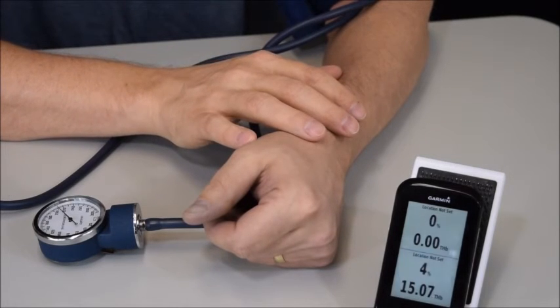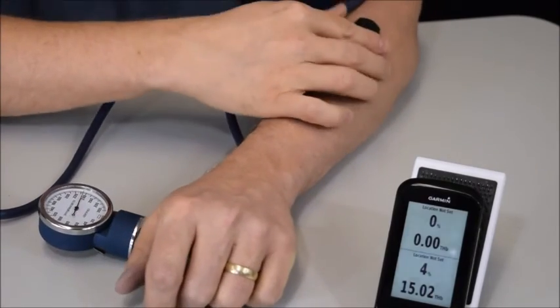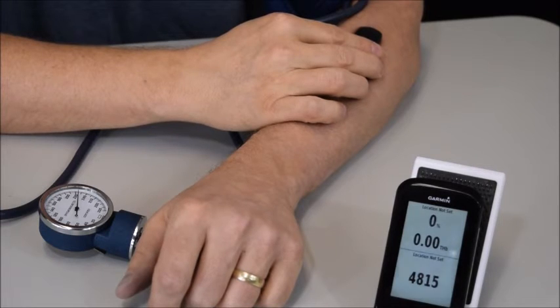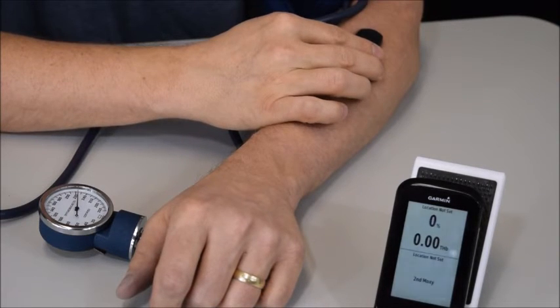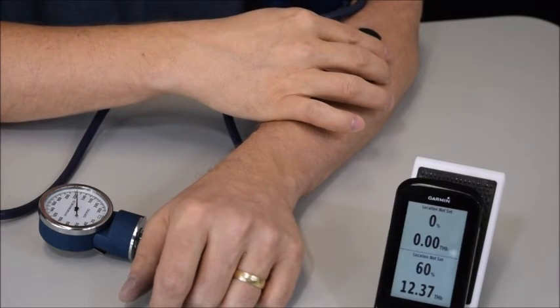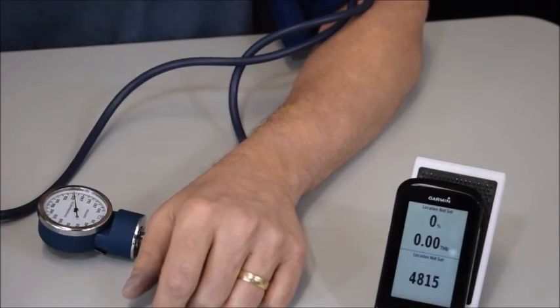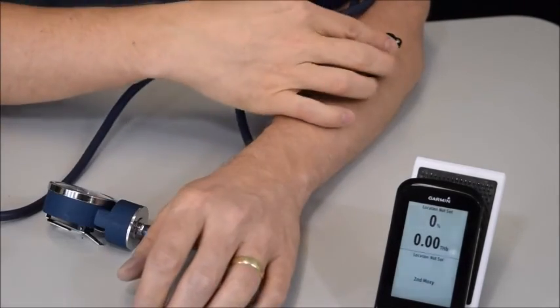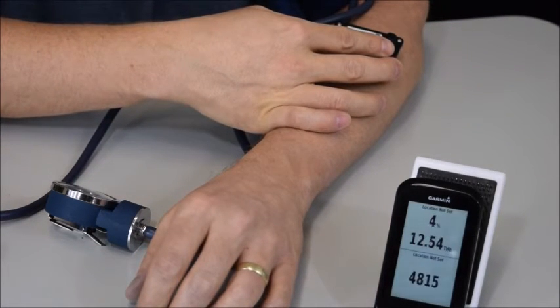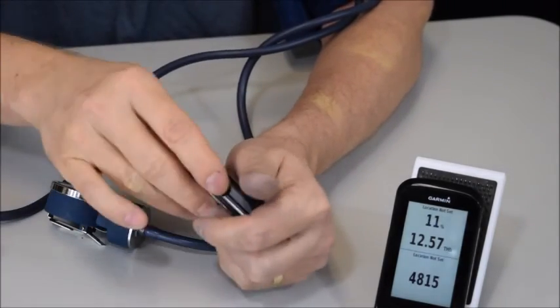So here it's reading 4 on the thenar eminence, and again, I'll go back to the forearm, and we're going to be reading something quite a bit higher. Give it a few seconds to update here. Yeah, we're still reading around 60. Let's see if the Moxie will still give us a reading. Yeah, so the Moxie is still reading in the single digits there. It's reading a 4 in that position.